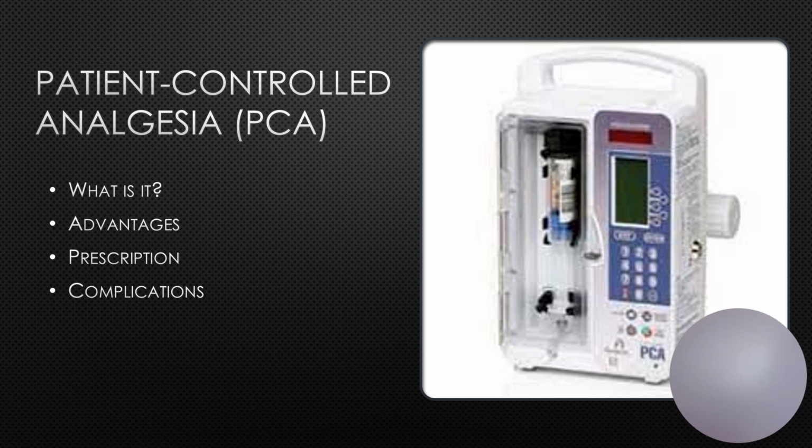It's used most often postoperatively or in clients that have chronic diseases, but these clients have to meet some requirements. They have to have severe, constant, or intermittent pain and an ability to understand and comply with instructions. They have to have that ability to press the button and not be sedated from other medications. Now, some clients can receive PCA analgesia, but they do require additional monitoring due to the potential for oversedation. So clients that have a history of sleeping disorders, respiratory or cardiac disease, kidney or liver failure, older adults, thoracic surgery, a lengthy duration of anesthesia during surgery, or morbid obesity are at higher risk for oversedation from the PCA, so they require closer monitoring.